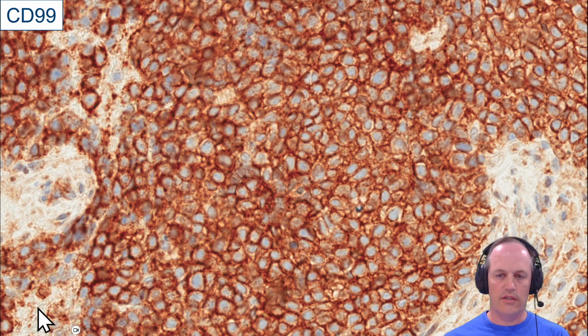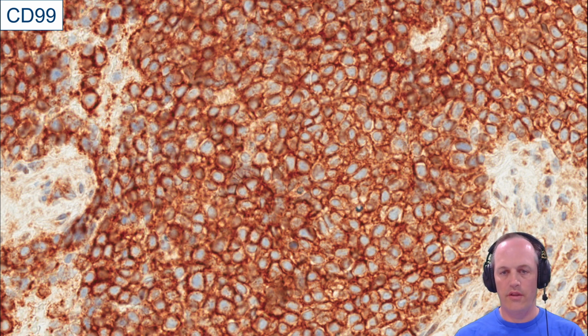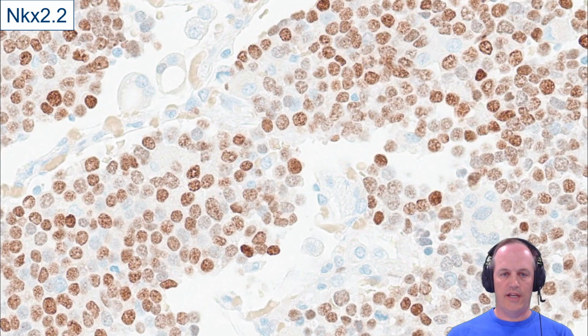If you don't see this, if you see something that looks patchy, that's when you're going to think about other tumors, other sarcomas that have maybe even an EWSR1 translocation, but have a different partner that make them something other than Ewing sarcoma. And of course, my favorite marker is NKX2.2, pretty sensitive, pretty specific, a nice nuclear marker, so very clean. And this is a really good marker for Ewing sarcoma that has the EWSR1-FLI1 translocations. And we'll talk a little bit about the molecularly defined classification later.